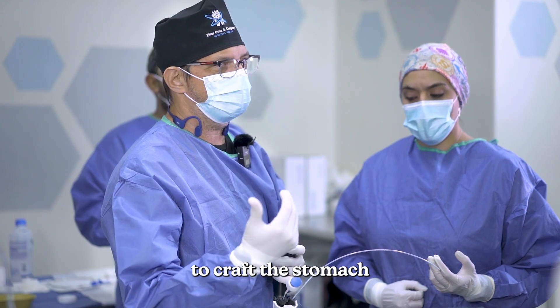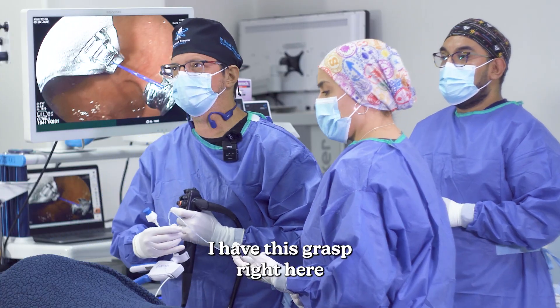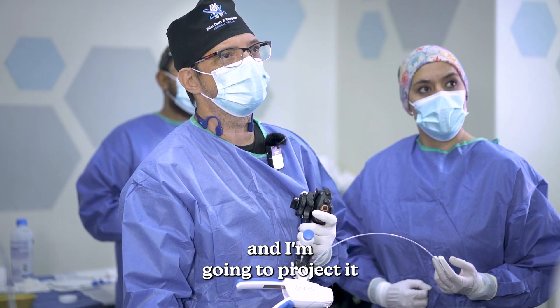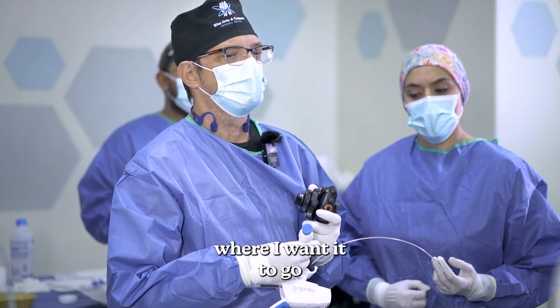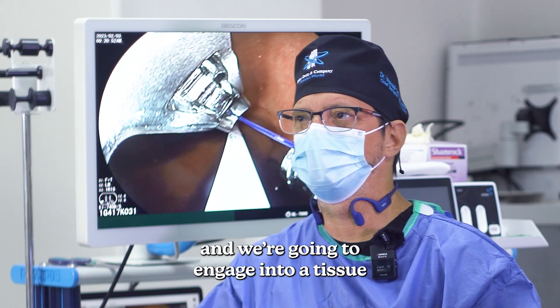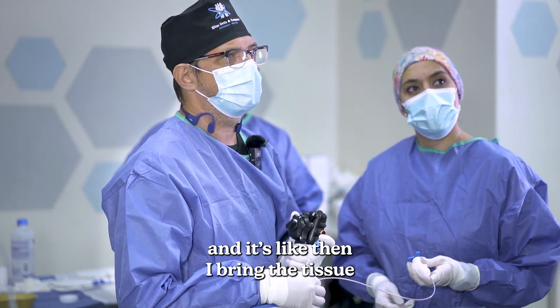We're gonna use that to craft the stomach. I have this grasper here that goes on another side, and I'm gonna project it where I want it to go — for example, here. And we're gonna engage into tissue. That's what it looks like.